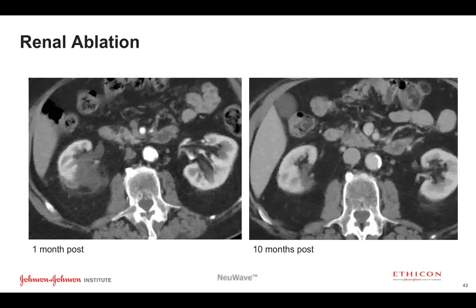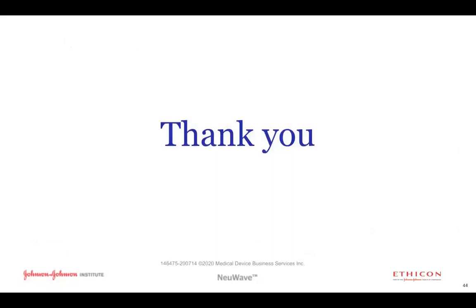It's just a rough rule of thumb. In reality, a lot of that changes depending on the lesion at hand. And so you'll ultimately have to make a decision based on your pre-procedural planning. There's no hard and fast rules. But essentially with a 5 to 10 minute ablation, you get a very nice outcome very fast. And it's a very nice tool to have in the kidneys.